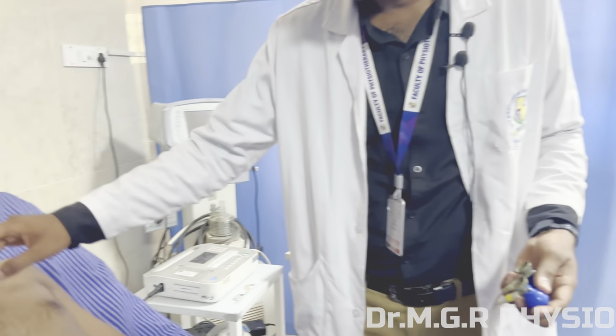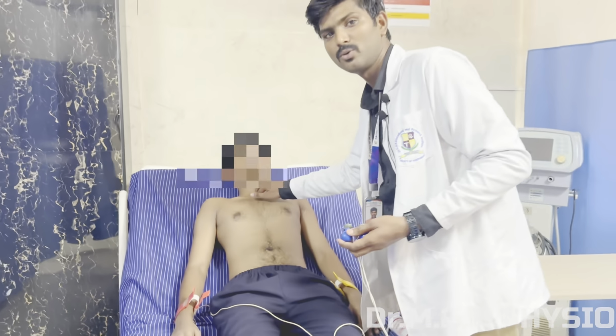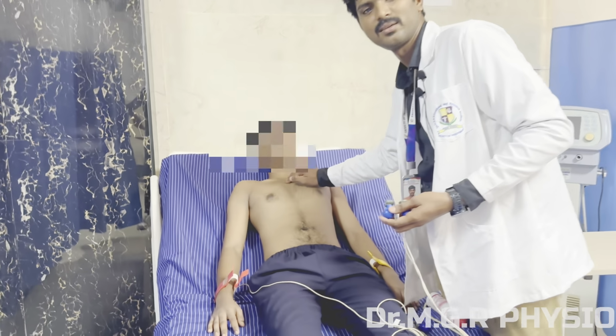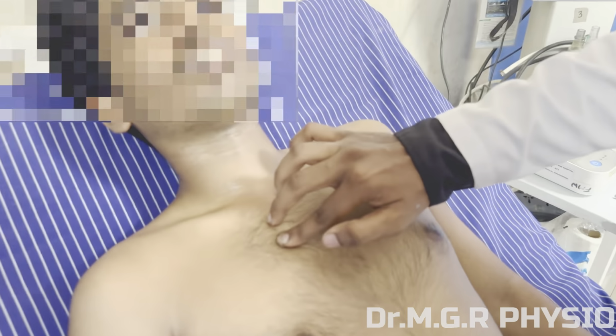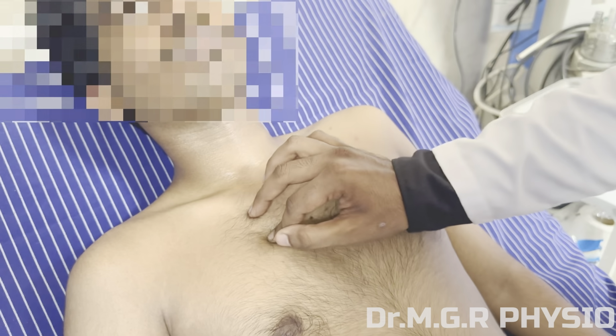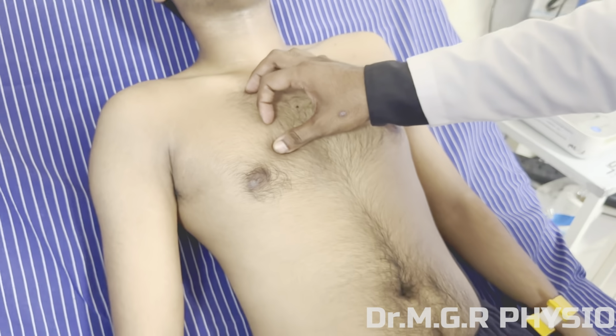The chest leads start with the intercostal spaces, so here is how to palpate the intercostal spaces. You have the jugular notch here. Below the jugular notch, you have the first bony prominence, and that bony prominence is the angle of Lewis. Adjacent to the angle of Lewis, you have the second rib. Below the second rib, the second ICS, then the third rib, then the third ICS, then the fourth rib, then you have the fourth ICS.